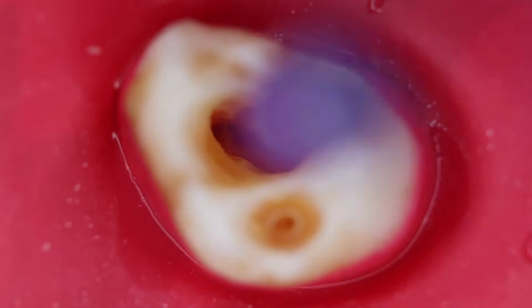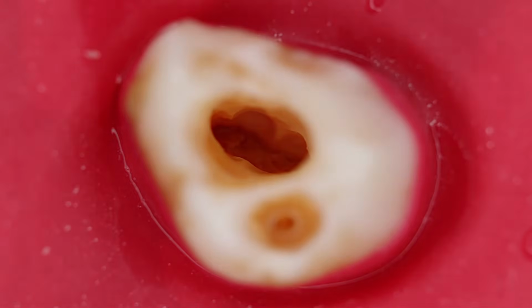This over here is the mesobuccal 1, sorry, the MB2. The MB1 is over here. See, this is the MB1. There is a distance between them. So you have identified the other canal, that is the mesobuccal 2. So we can enlarge the orifice.